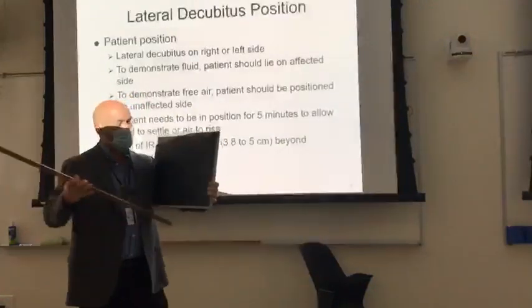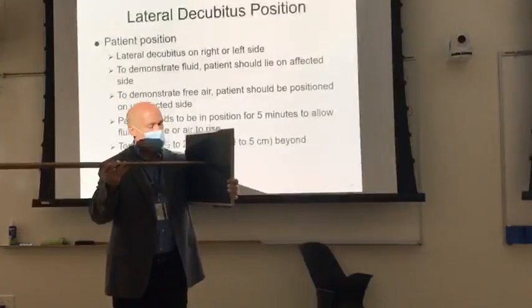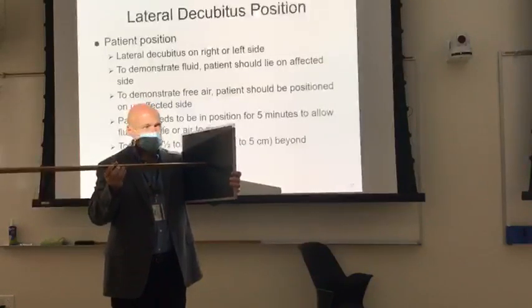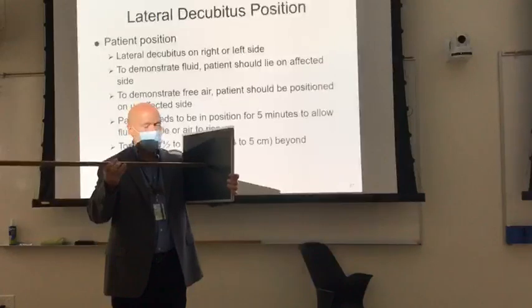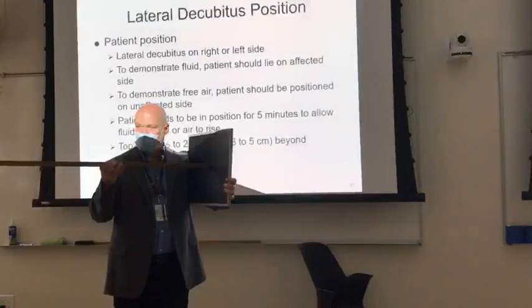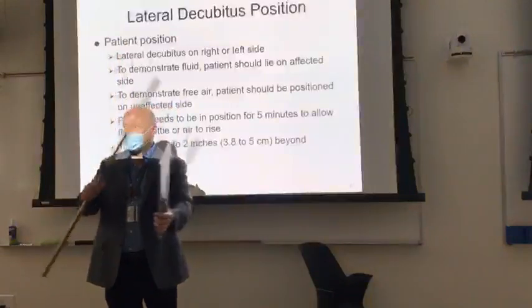All right, so we want to put the central ray perpendicular to the image receptor, right? For reasons we'll talk about throughout the semester. But the central ray comes from a point source. It comes from a little bitty point source, kind of like a light bulb.